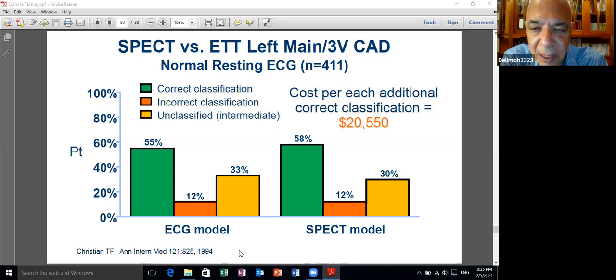انت تستخدمه في مين. فالكومنست كونترا انديكيشن ليه مش ليفت باندل برانش بلوك ودبليو بي دبليو واس تي ديبريشن ولا بيست بي. الكومنست انك تعمله او انك تستخدمه في اسيمتوماتيك اندفيدوالز. يعني الاكسرسايز اي سي جي مش معمول في سكريننج البوبيوليشن. سكريننج البوبيوليشن زي ما انا وريتكم السلايدز دي مهمه جدا.